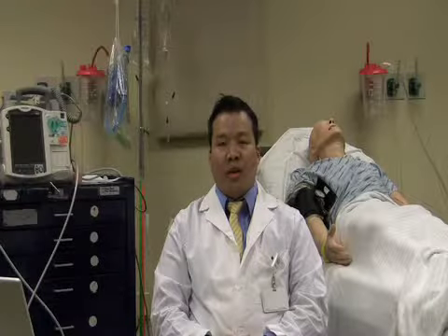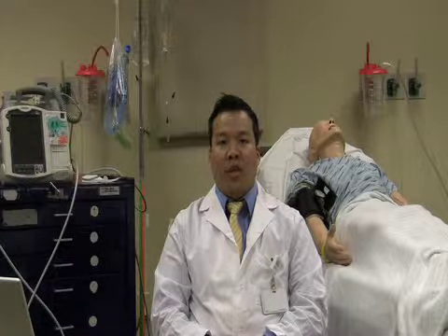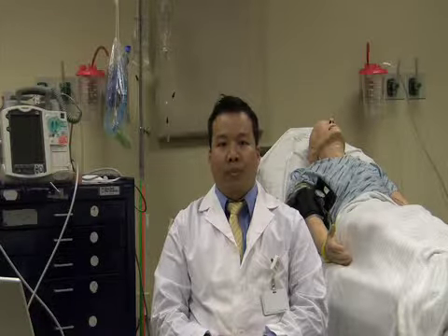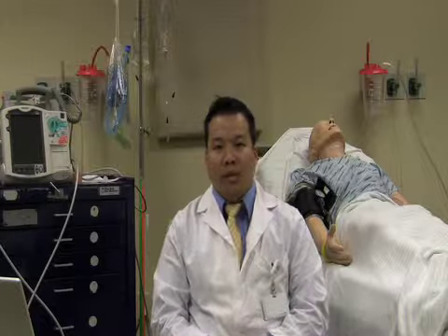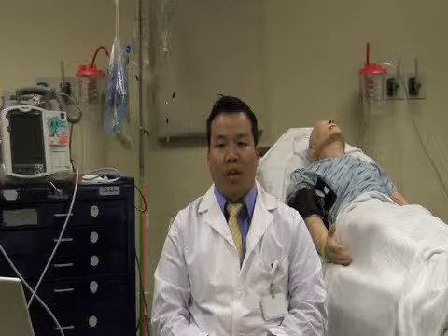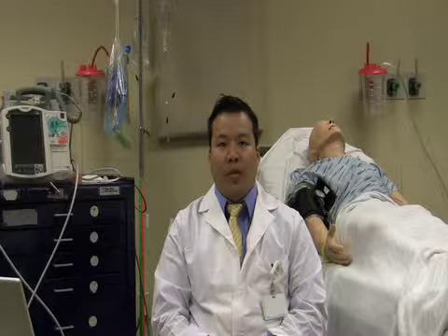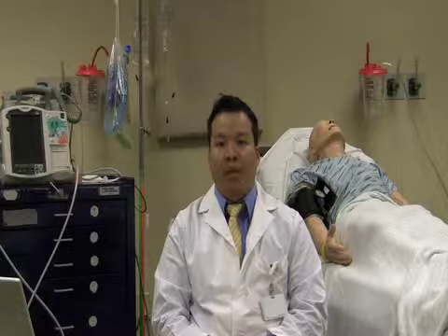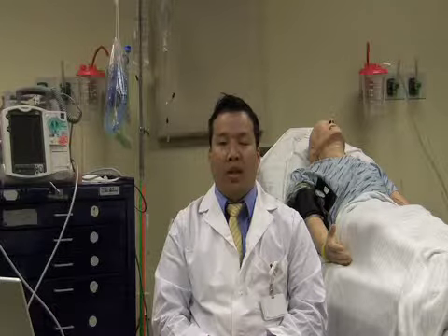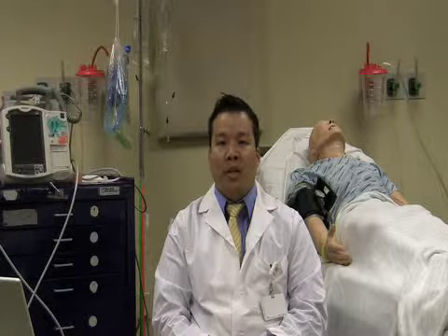The presence of a pacemaker should increase your concern for any potential cardiac disease. This may be either ischemic or arrhythmia related. For this reason, these patients should be placed on a cardiac monitor, as this may provide information in regards to whether or not the pacemaker is properly functioning, or whether or not there is any tachydysrhythmia that may be the underlying cause of the patient's complaint, particularly in patients that present with altered mental status or confusion.